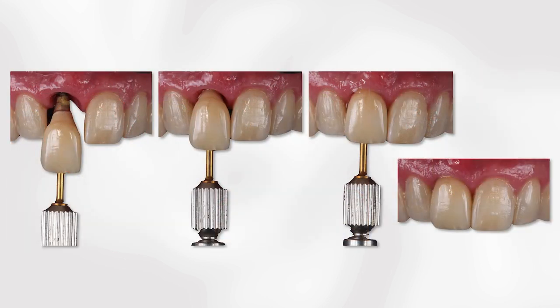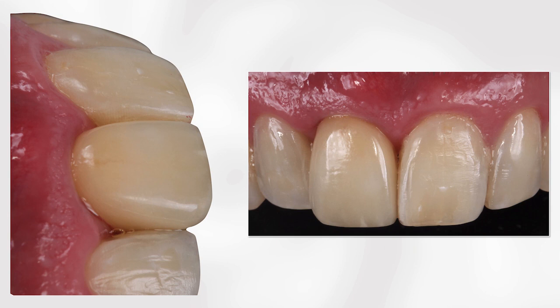Here, during the final crown insertion, a screw-retained porcelain crown, pay attention once more to the correct anatomical contour of this final restoration in the most important area of this porcelain crown, the cervical area. These pictures were taken right after crown delivery.